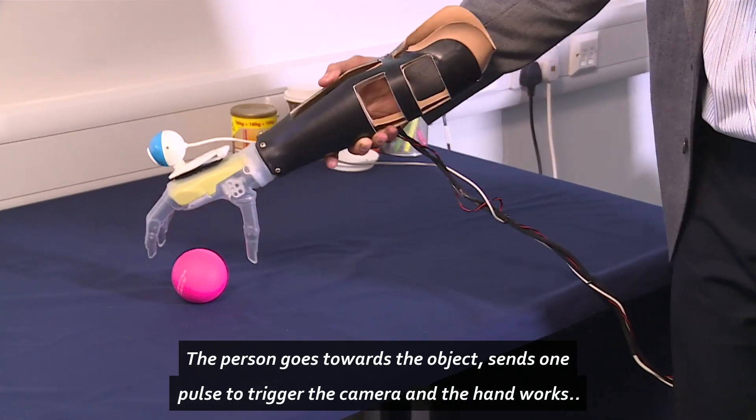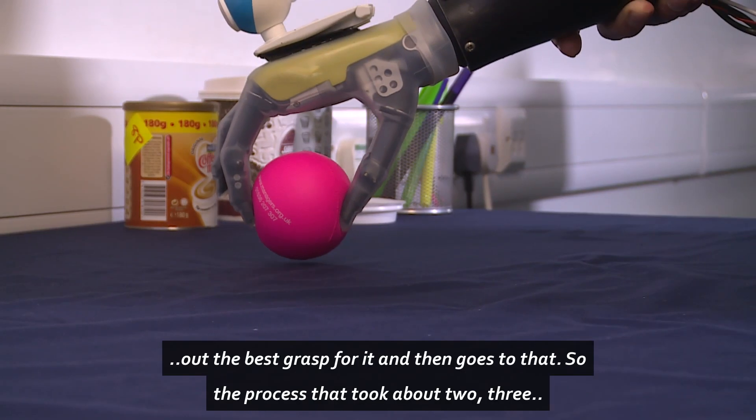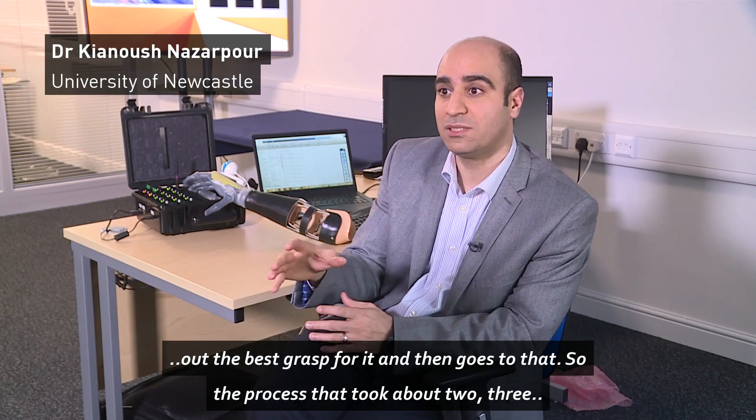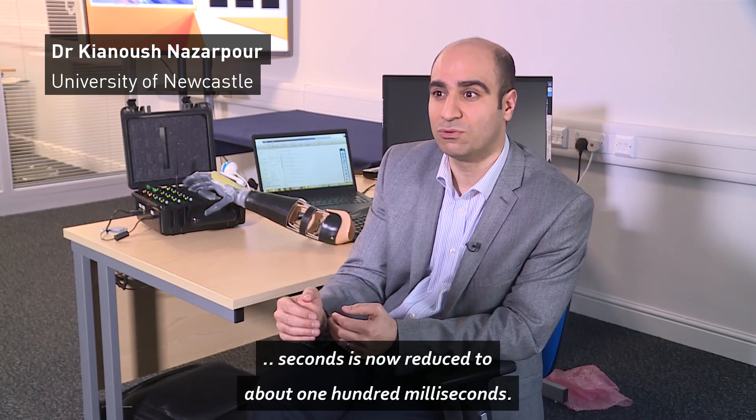The person goes towards the object, sends one pulse to trigger the camera, and then the hand works out the best grasp for it, and then goes to that. That process that took about 2–3 seconds is now reduced to about 100 milliseconds.